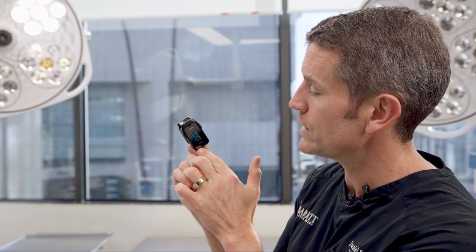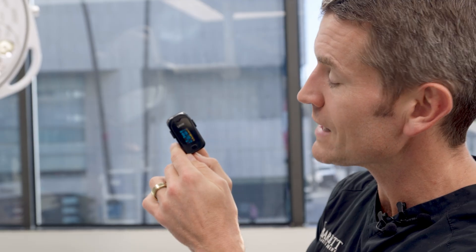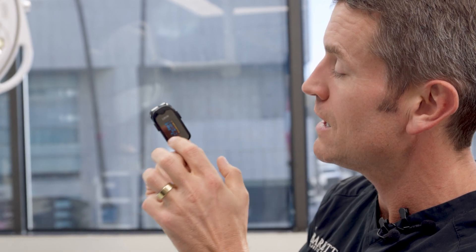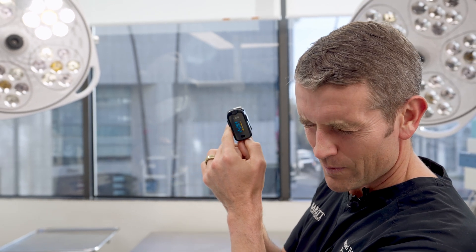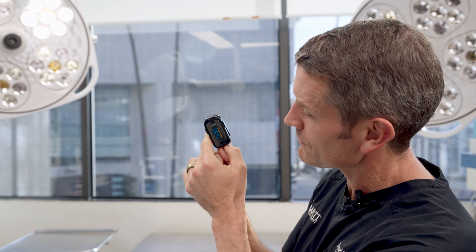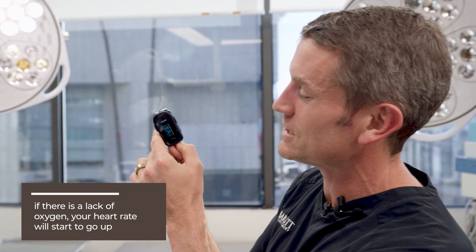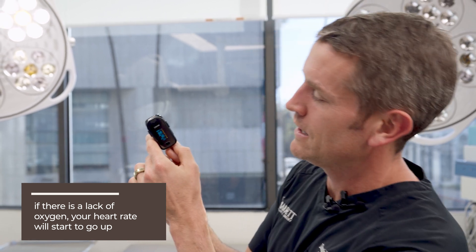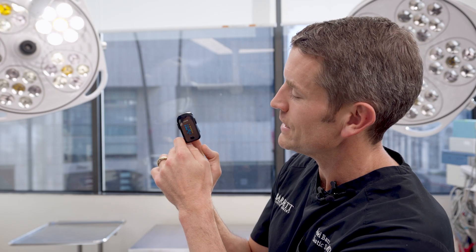The other interesting thing — if I stop breathing right now, you're going to notice it takes a while for this to start registering the lack of oxygen. You can see my heart rate going up because it's like 'why aren't you breathing?' It's still 98 because the capillaries in my finger are getting perfusion from blood already in my system. After holding my breath, heart rate went up to 91-92, and now it's starting to dip: 96, 95, 94 — a little transient dip, just from a 30-second breath hold.